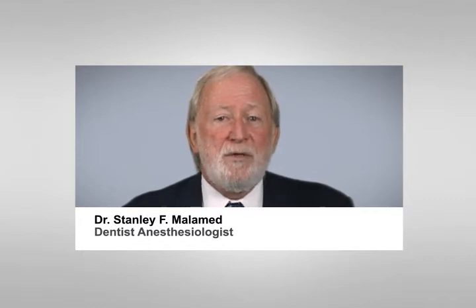The P-ASA injection is very useful for those dental procedures performed in the maxilla. It effectively provides profound soft tissue and pulpal anesthesia of multiple maxillary teeth from a single injection without producing collateral anesthesia to the lips and face, thus allowing greater post-treatment comfort. Additionally, those procedures that require a more accurate assessment of the patient's smile line during treatment, such as aesthetic restorative dentistry, can be accomplished with this maxillary injection with no drooping lip.